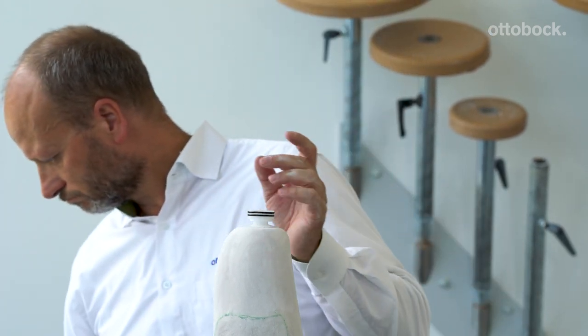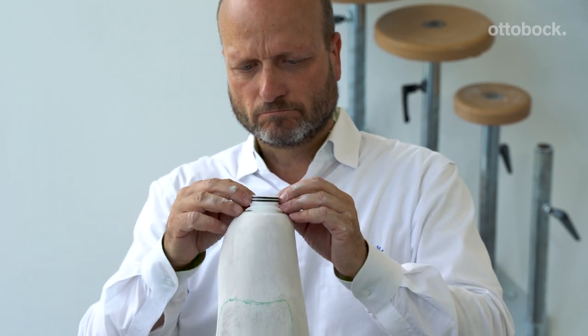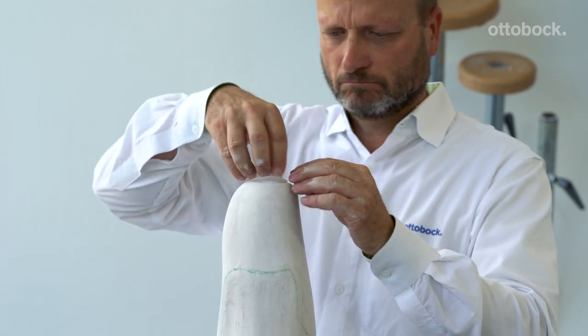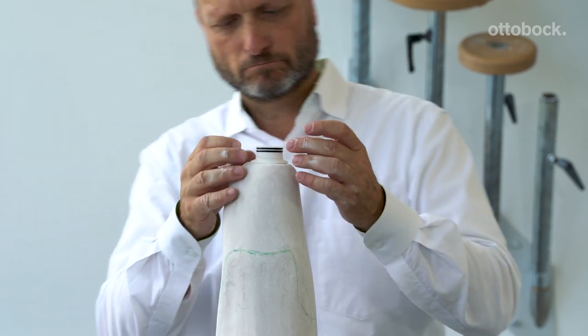Take the silicone dummy provided in the DVS kit and put it over the piston dummy. This will create a seal for draping your plastic and make it easy to blow the check socket off the model.